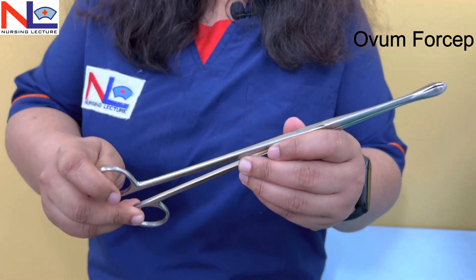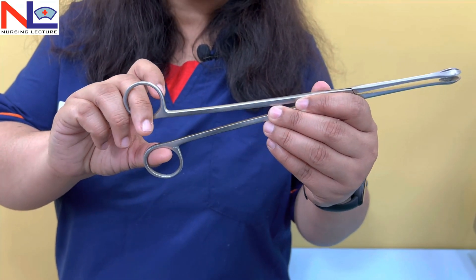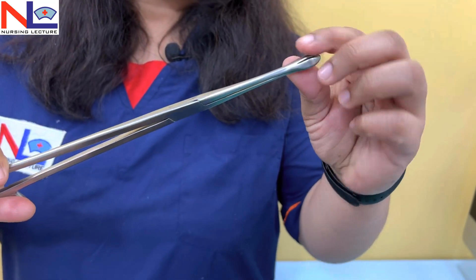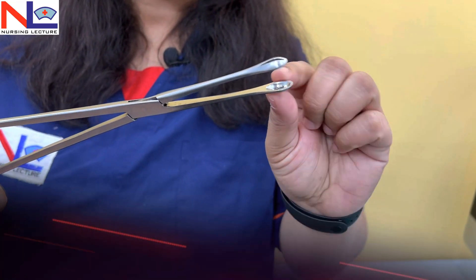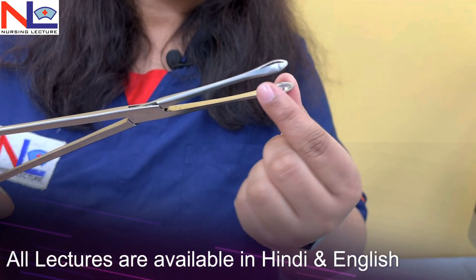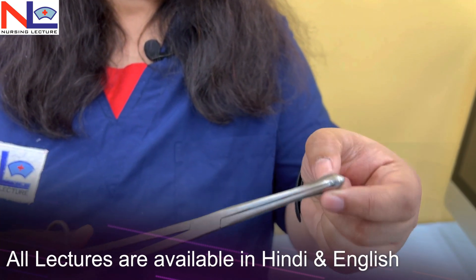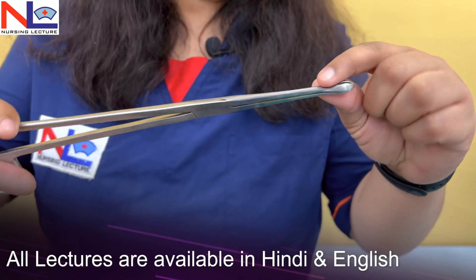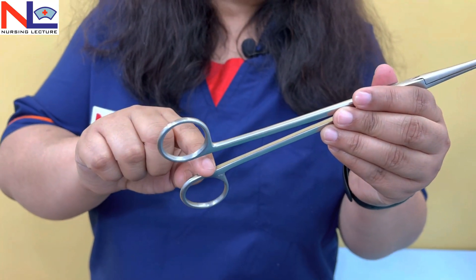You can appreciate its structure — it has no catch, that is, the ratchet lock is absent. On the tip of this instrument there is an oval-shaped or spoon-shaped ending. The tip is spoon-shaped with some fenestrations on top of it. So here the ovum-shaped tip is present with some fenestrations and there is no lock.